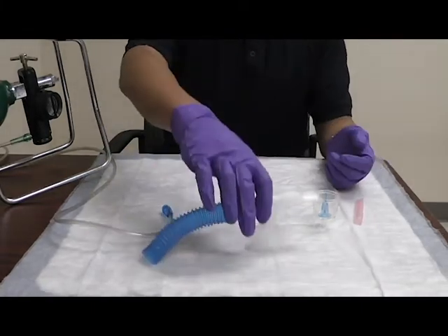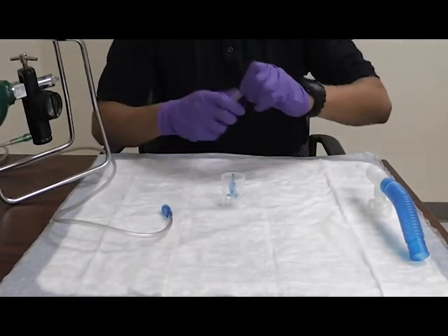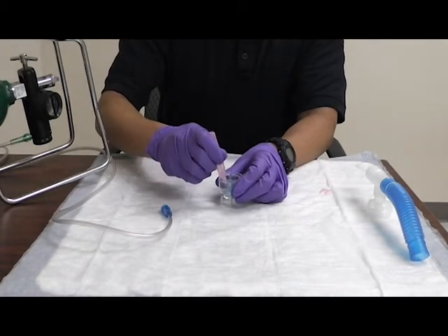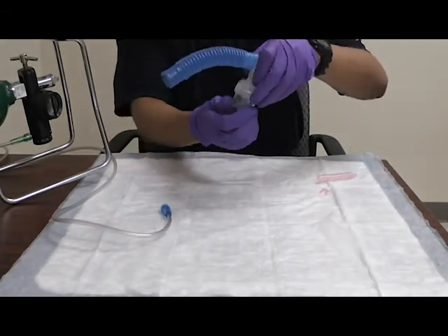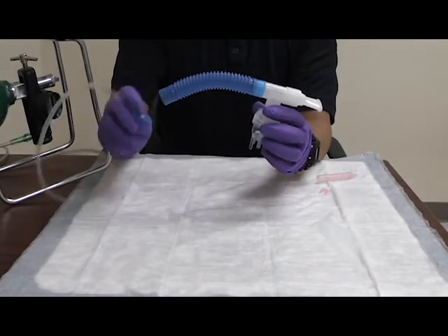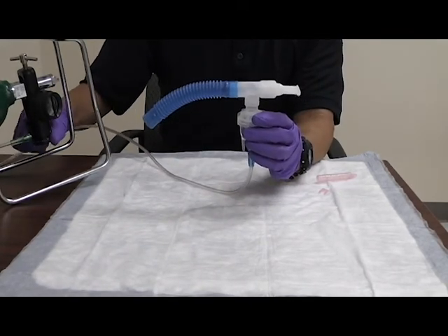Once you've attached all the parts, you're then going to add your medication to the unit. I'll attach the unit to the rest of it, screw it on tightly, make sure everything's together. I'll then attach my O2 and adjust my flow rate to roughly about six to eight liters for proper flow.